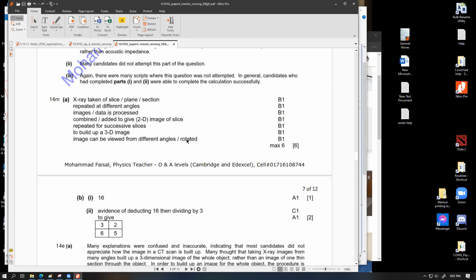You can stack up all these numbers in a 3-dimensional viewing model where you can see different parts of this whole tissue arrangement by rotating it in a computer environment. A 3D object cannot be viewed unless it is 3D printed, but 3D printing a patient's inside is not really needed for diagnosis because doctors only need to know what is there. They don't have to physically touch it to go for the treatment.